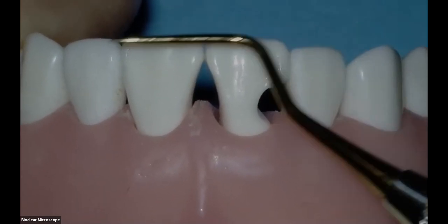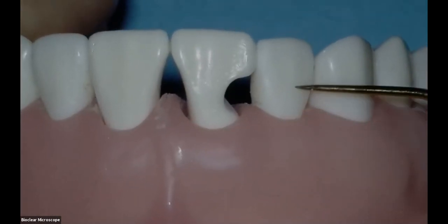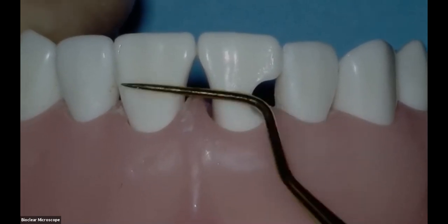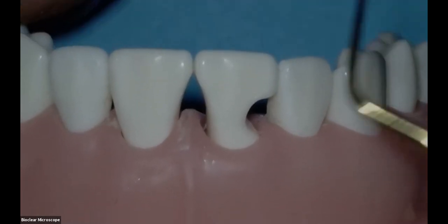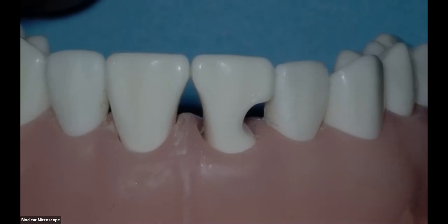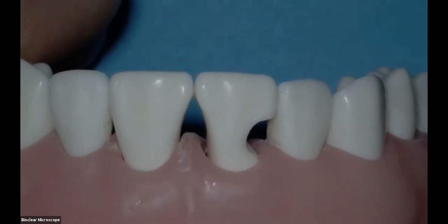And then once I finish the centrals, the patient's going to come back and possibly do the laterals and the canines with an aesthetic upgrade. So we'll be adding a little bit of volume onto the teeth, about 0.5 millimeter to help with blending, all right? And so let me, can I have my models over there?